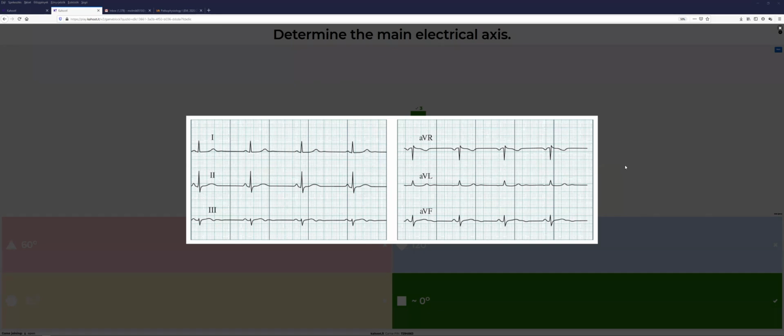Making a diagnosis, because a lot of disease is associated with an abnormal axis deviation. We are not interested in those situations when the anatomical axis is about the same as the electrical axis. We are interested in when they are not, so when you cannot explain the axis deviation by the anatomical situation. For example, if somebody is obese or elderly, the axis usually is around 0.